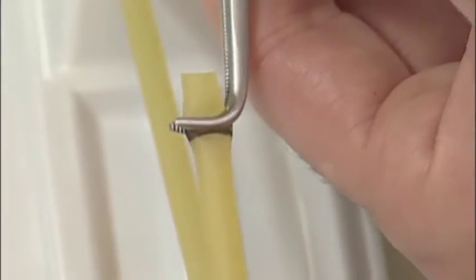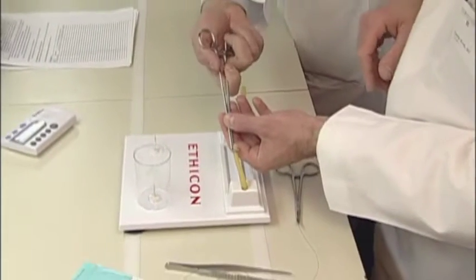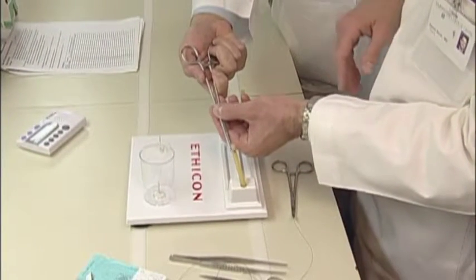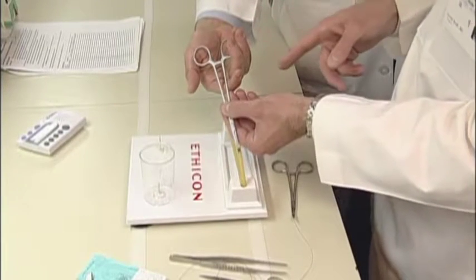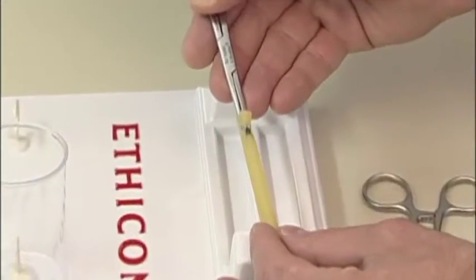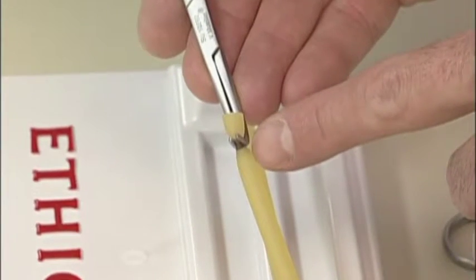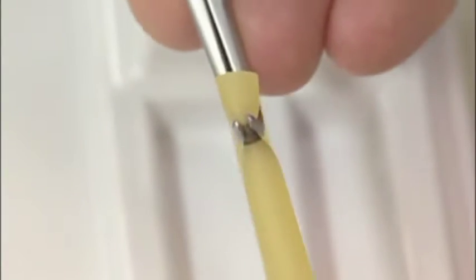Now for this exercise you will need either a proctor or an assistant, whether you're in an assessment mode or in a practice mode, such that the assistant can hold the right angle clamp. And for this particular exercise we want to hold the right angle clamp at about a 45-degree angle such that I can easily see the edge of the clamp and the target zone as shown here.